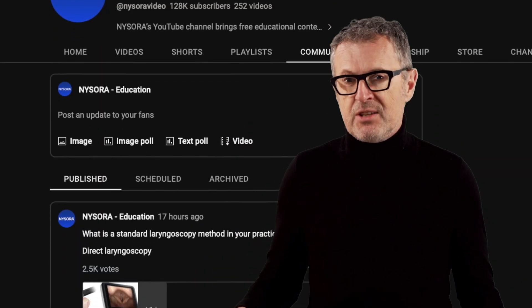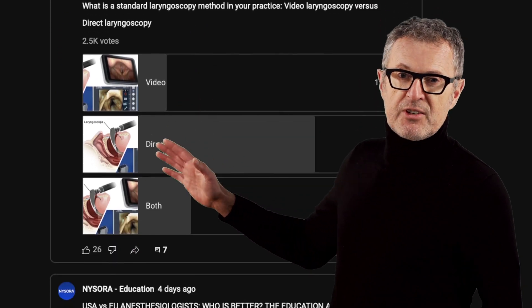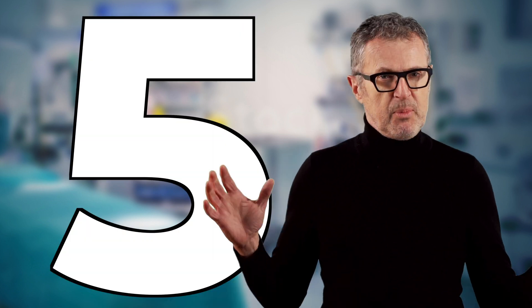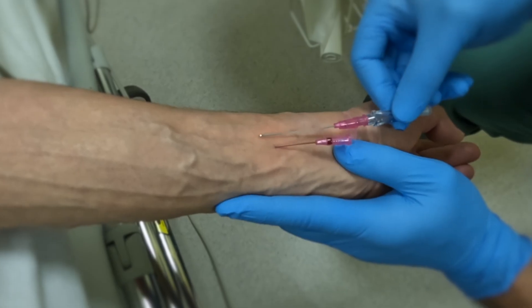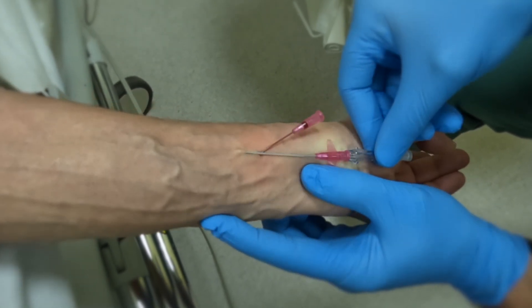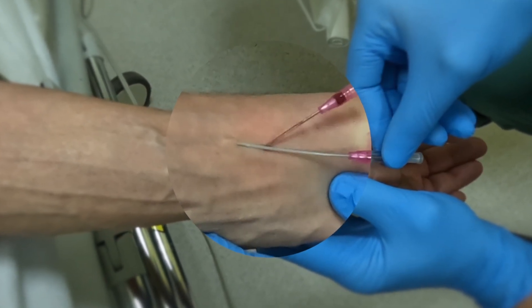Bending the needle-catheter system is controversial, and in the community feed you can see there's a lot of discussion as to whether you should do it — I personally do it all the time. Number five: insert the needle into the lumen of the vein fast to avoid the vein rolling, particularly in older patients with thick-walled veins. Now let's see how we can apply these principles to the near-impossible vein cannulation video.